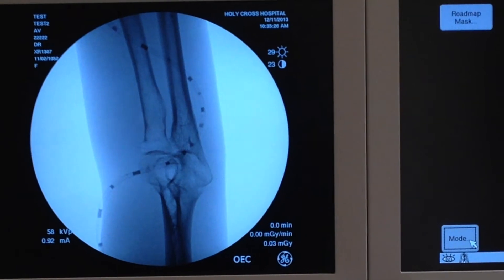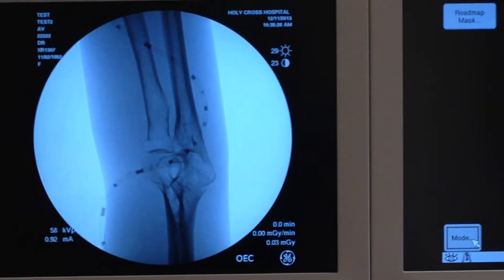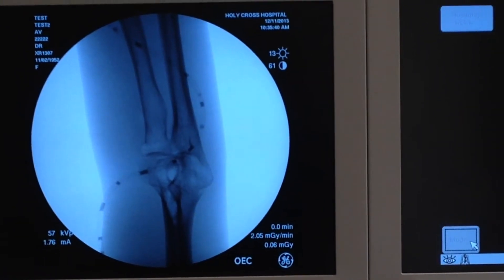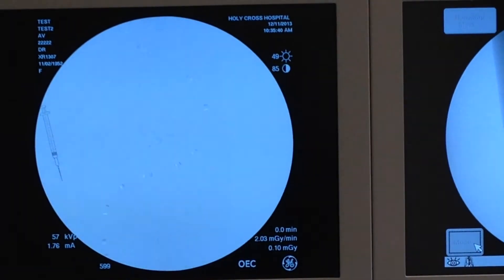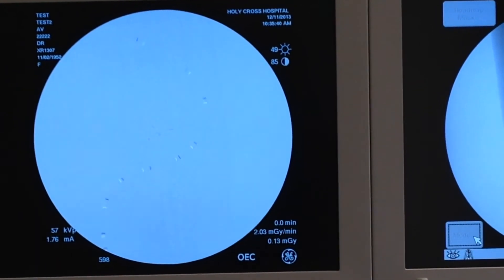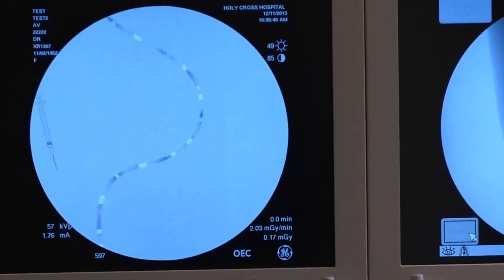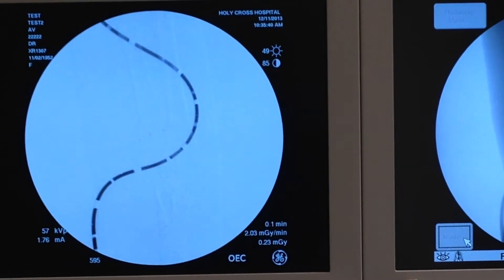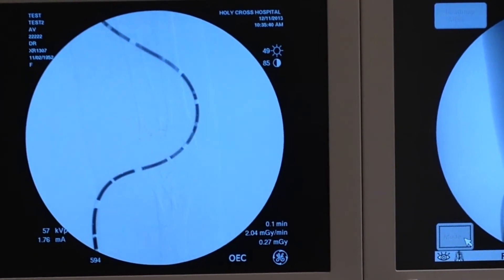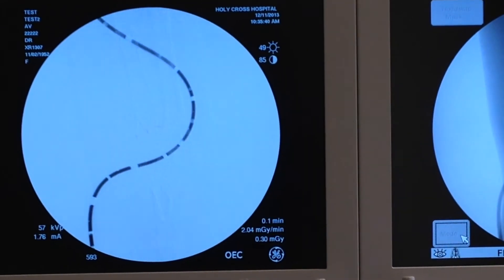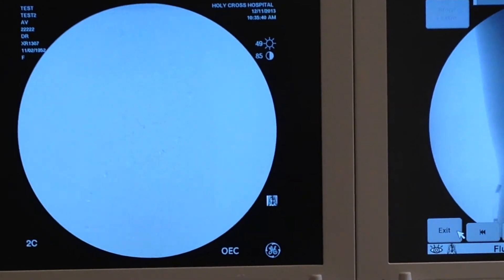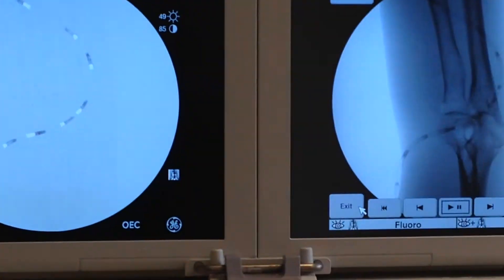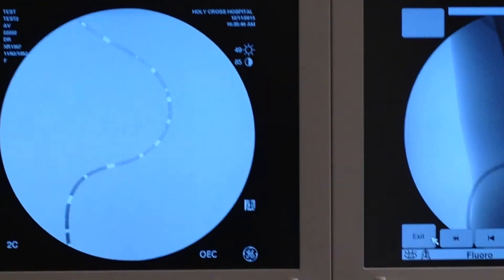Alright, and subtract. I am going to start the subtraction, which is the eye plus button, until you see the syringe and the doctor is going to start injecting. OK, stop. And I am waiting for him. Now I am stopping because the doctor told me to stop.